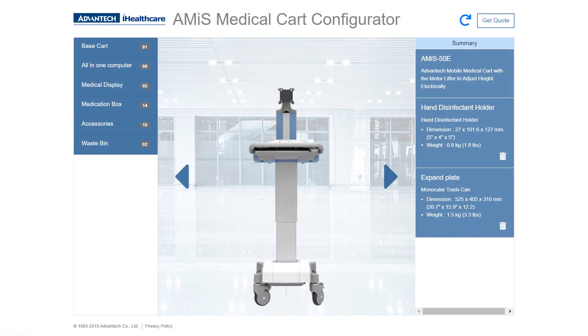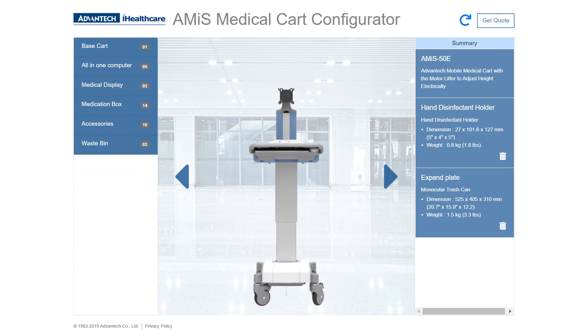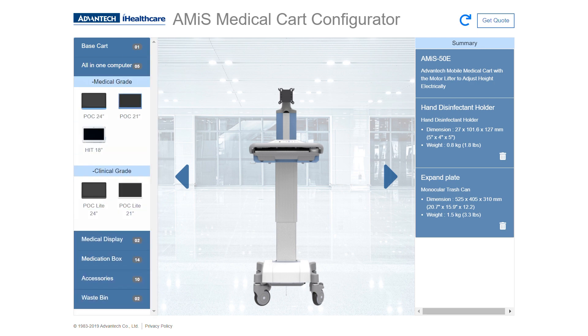Now that we're in the tool, you'll see that when you click Base Cart, the AMiS-50E is loaded for you. You have your choice between all-in-one computers or medical displays. Let's take a look at the all-in-one computers.